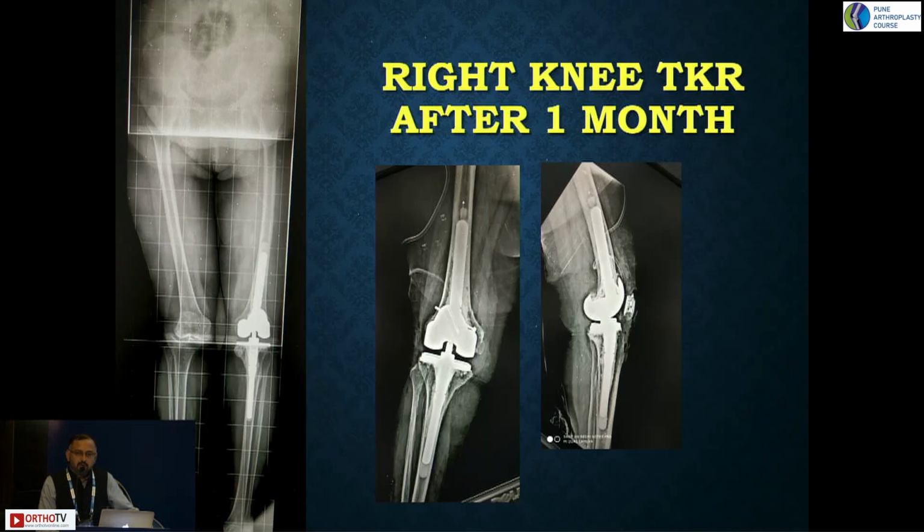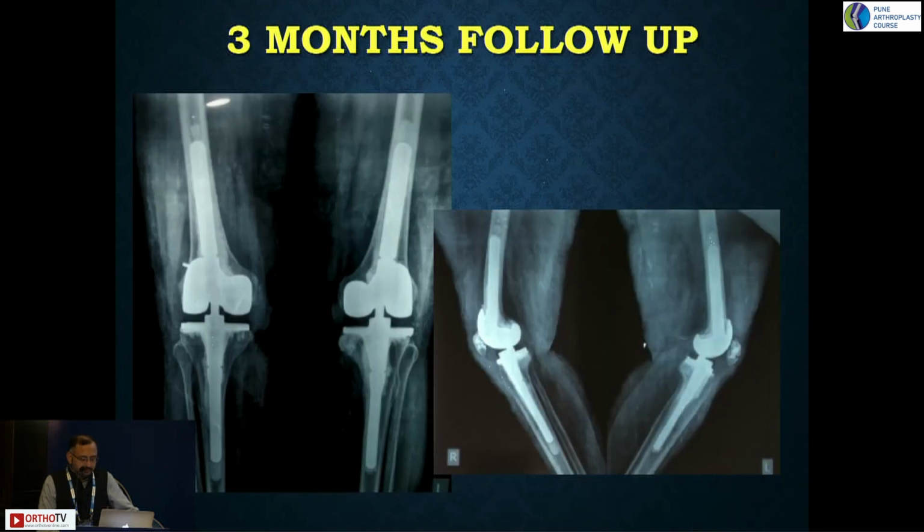You will have complications of tightness of the condyles, avulsions. As the bone is very osteoporotic because of disuse, you will always have chances of periarticular fractures. So if at all you encounter them, you have to be ready with the screws to fix them.